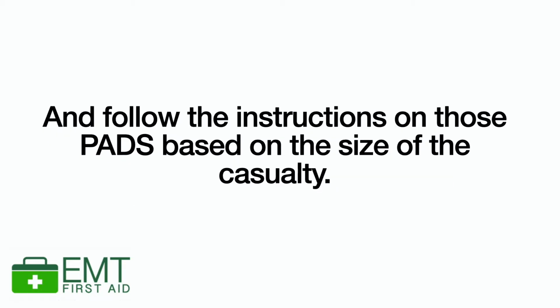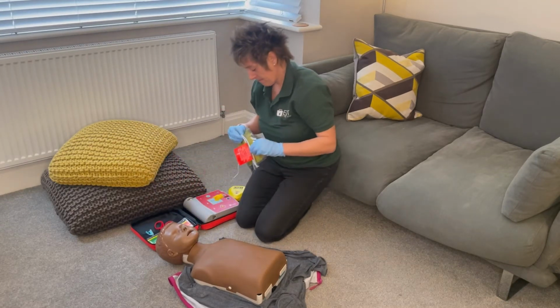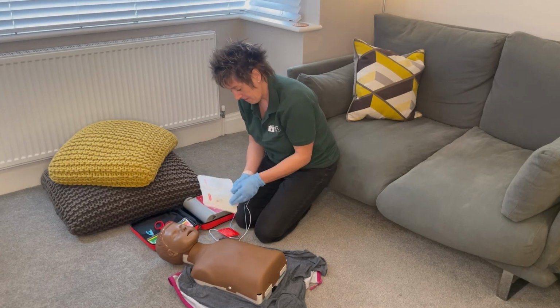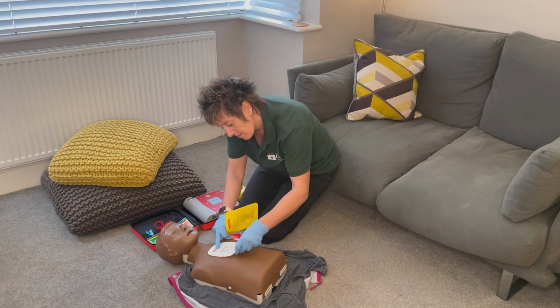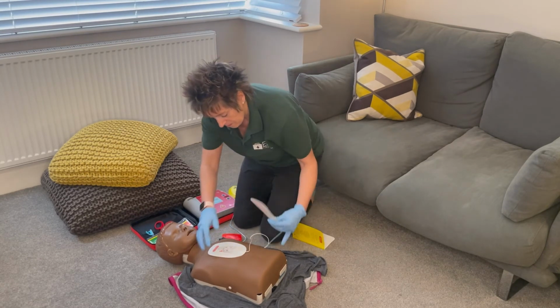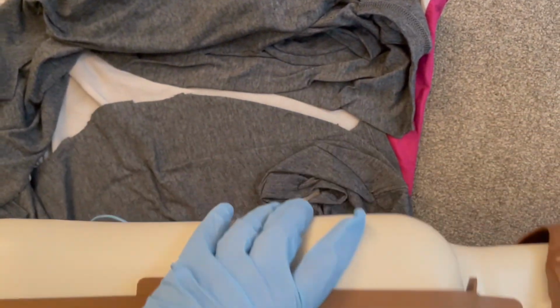If you remember, on an adult, we had them on the clavicle, the collarbone, and on the left-hand side of the body, so the shock will go through the heart. We can't put them like that on this child because their frame is too small, and that will mean the shock will go over the heart rather than through it. So we're going to place one on the front of this child, and then we're going to place one on the back, so the shock will go through the heart.